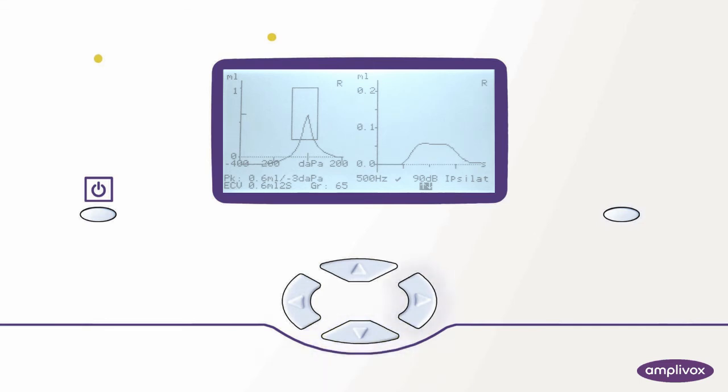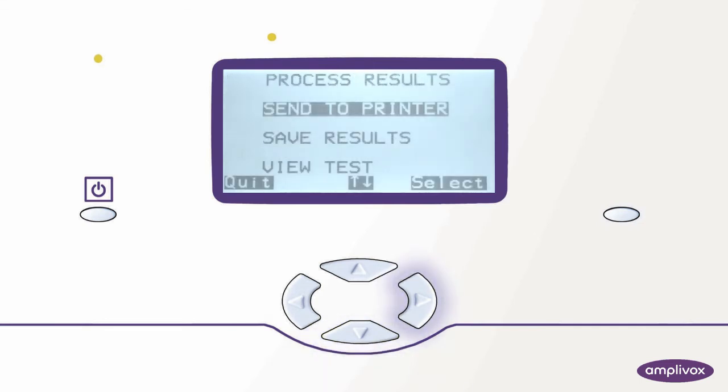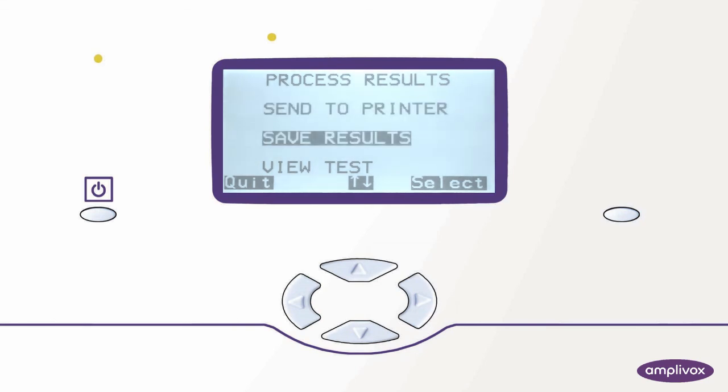If you want to process the data, select the right key to have a look at your options. You can now decide if you want to print the test results, save them to the internal memory, review them again, or return to the main menu to continue with another test.